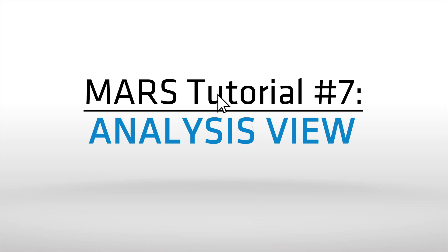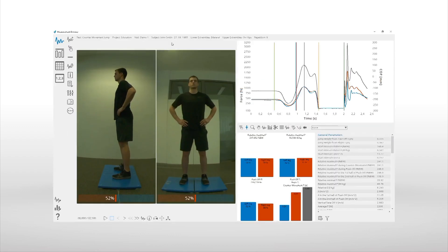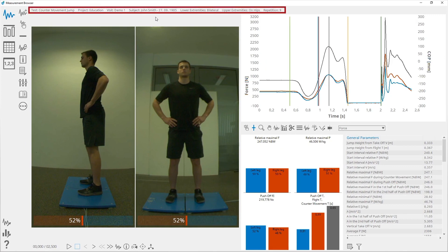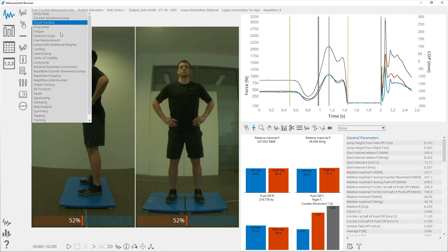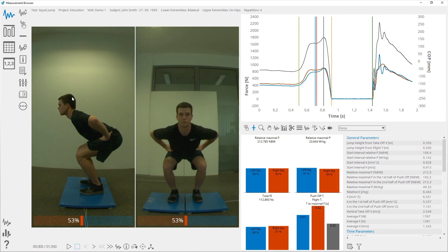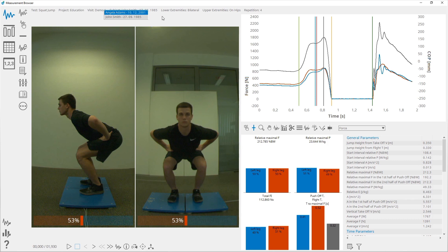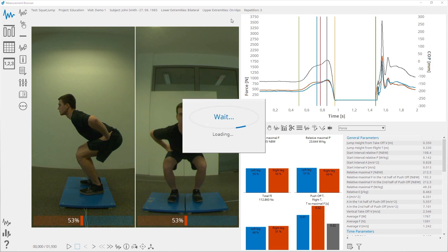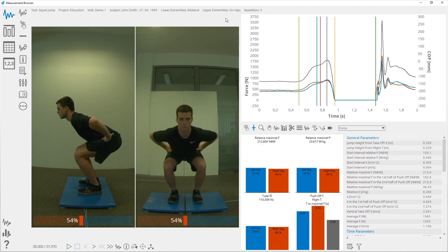The analysis view shows the data of the currently selected measurement. At the top of the window there is a navigation panel where you can select measurements. It only shows you the combinations of entries that have had at least one measurement made. On the left side of the analysis view there is a list of controls that affects only the analysis view.